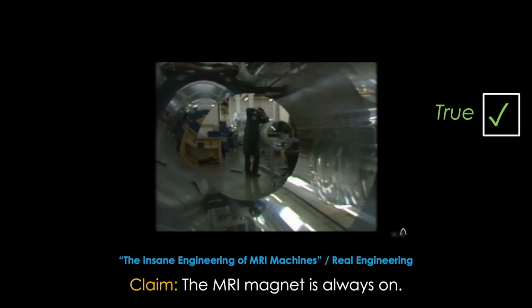This is true. Pretty wild technology, right? Once they charge the main superconducting magnet and cool it down, as long as the coolant system functions appropriately and maintains the temperature, the magnet is always on, which is amazing but also the source of countless accidents where people mistakenly believe that since the machine is off, so is the magnetic field, and bring ferromagnetic objects into the room, sometimes with deadly results.